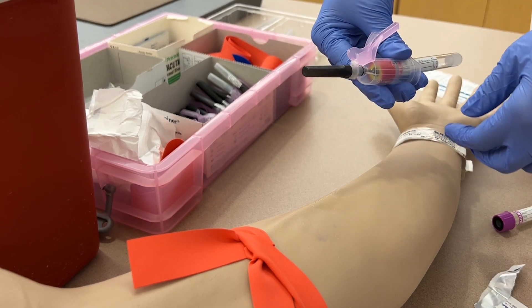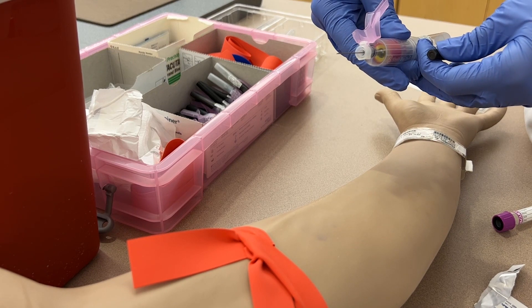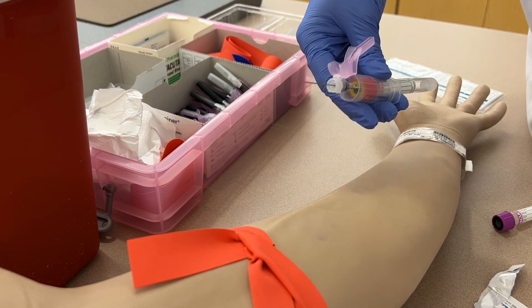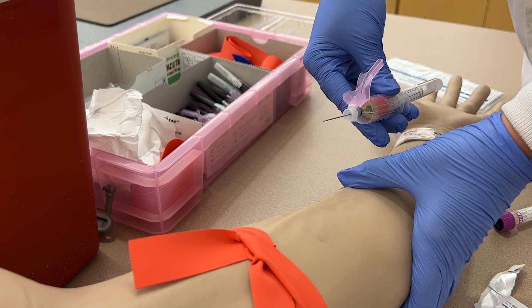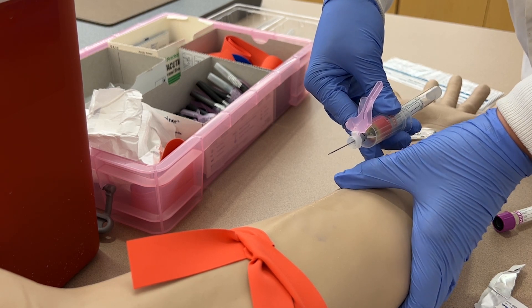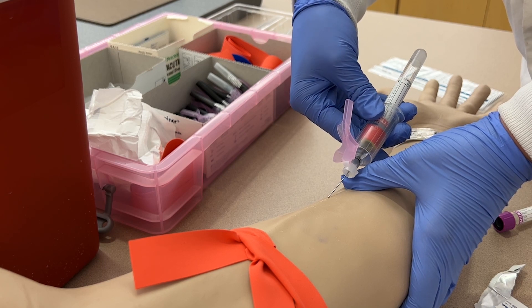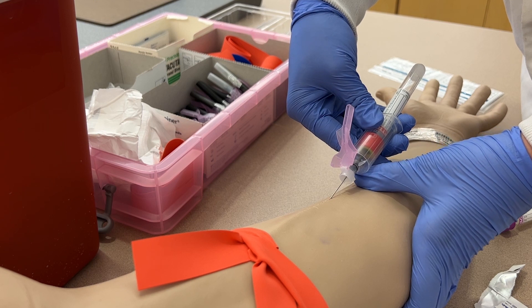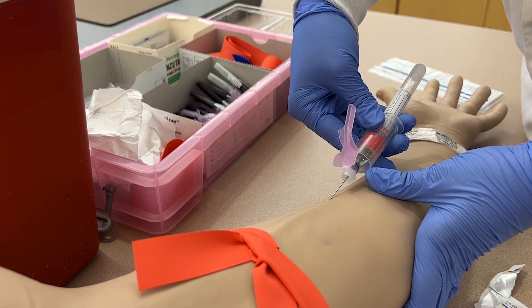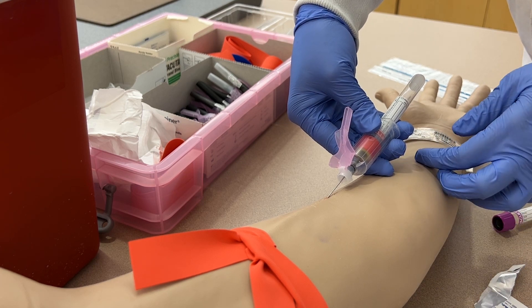Now that the alcohol is dry, remove the cap of the needle and inspect the bevel for damage. Then use your non-dominant hand to anchor the vein by pressing your thumb into the patient's skin below the draw site and pulling down on the skin. Insert the needle with the bevel up at a 15 to 30 degree angle, remove the thumb that was anchoring the vein, and rest the fingers of your dominant hand against the patient's forearm to hold the needle steady.